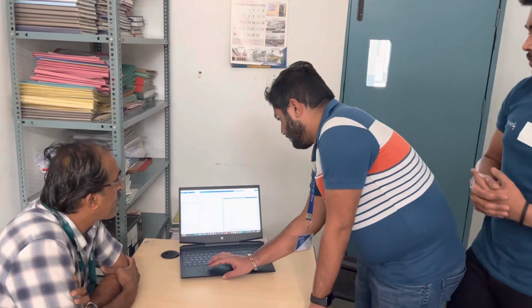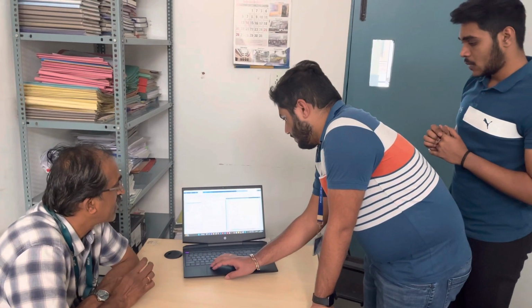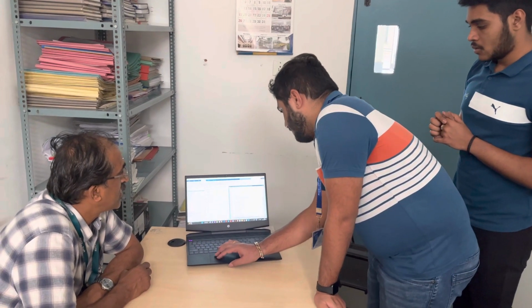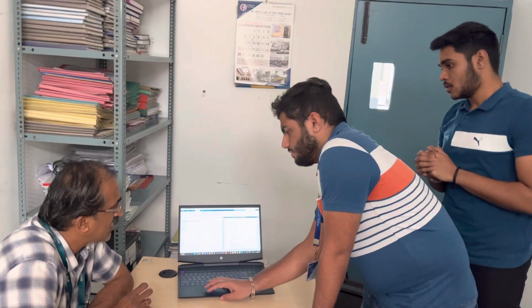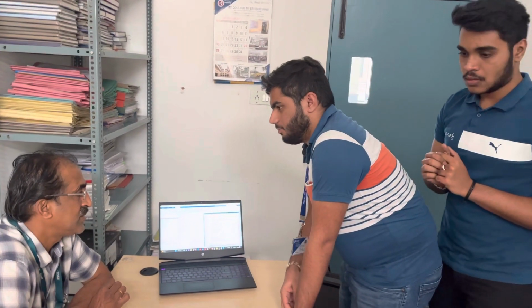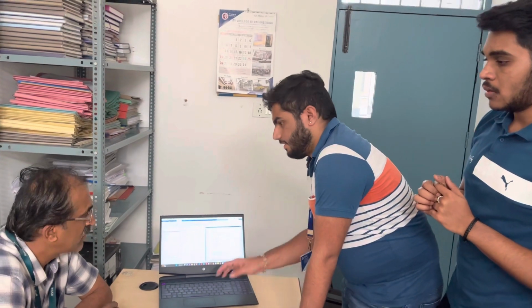So basically, first we are plotting the samples. We have got the original signal pattern, so we are plotting it. Then we are applying the window technique, the rectangular window. Why rectangular window? So we get the one, as there are no variations. We can check the average easily.